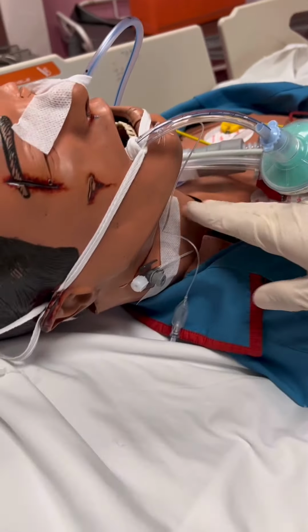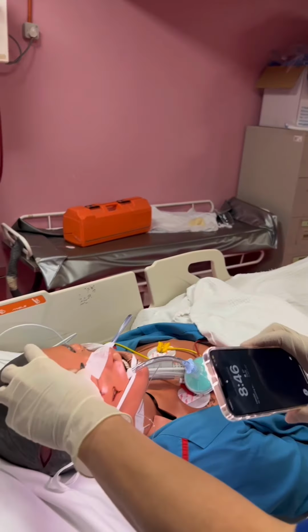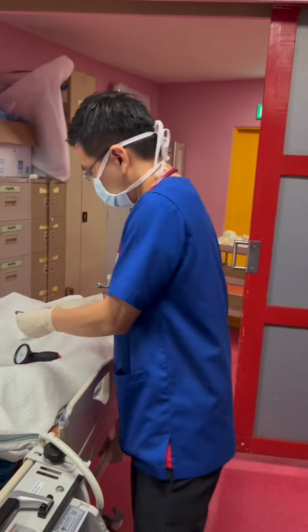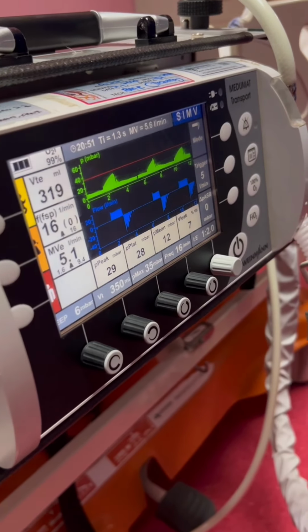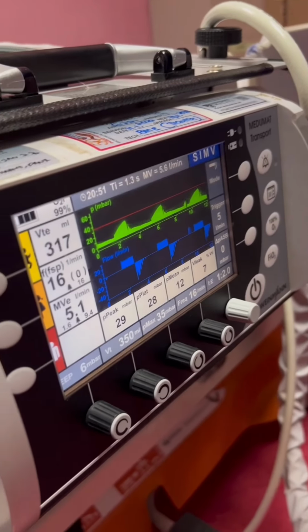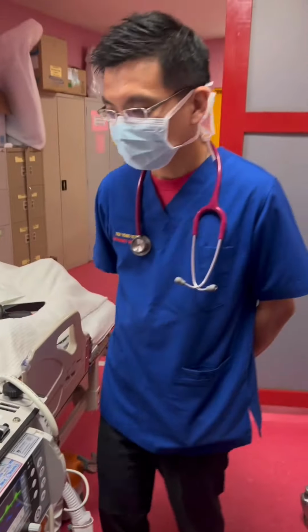Check for the disability. GCS, ensure the patient is properly sedated and the pupils are reactive. Observe the ventilator. Ensure that the setting is correct. Observe the waveform, there's no leak or any ventilator asynchrony. Once everything is checked, the patient is safe for transfer.